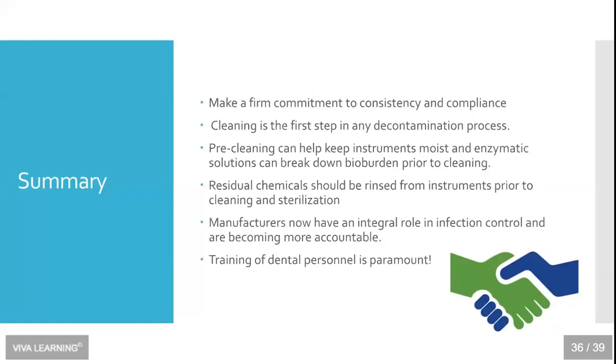Manufacturers have an integral role in infection control, and they're becoming more and more accountable, and that's why I stress the importance of following the instructions for use. And of course, finally, training of dental personnel is paramount.